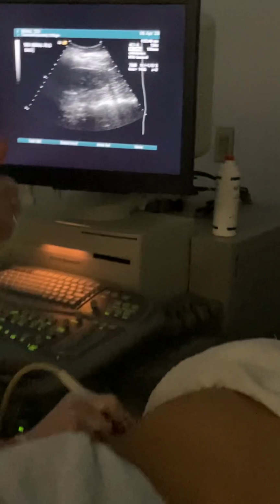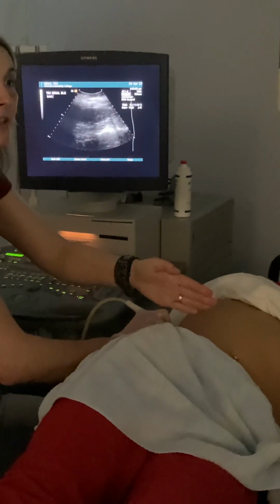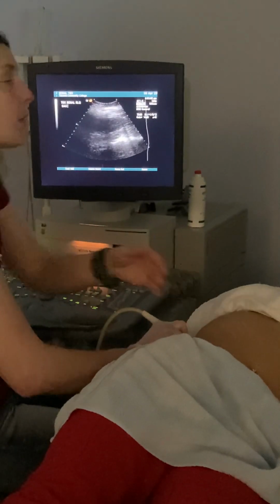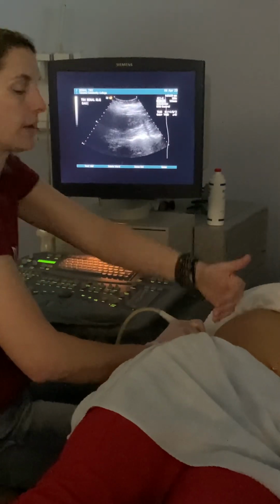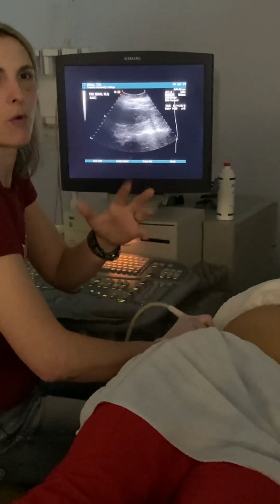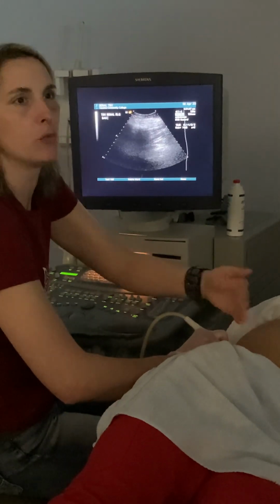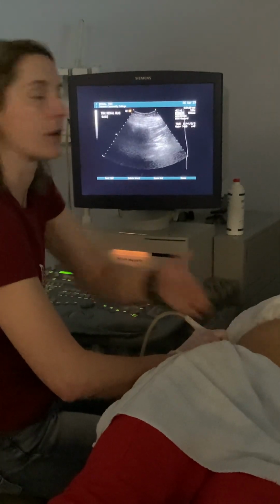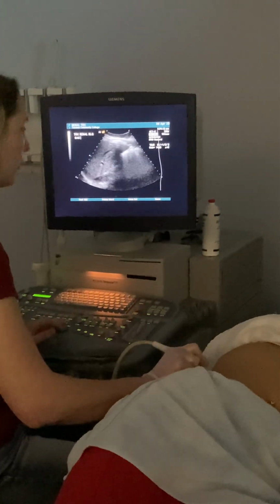So those ones are the easy ones. And like Masha brought up, if we have one that's totally horizontal in here, we just have to pick a side. So I might say superior / lateral right. So like, hey, I called the superior the lateral right aspect. So we might have to kind of make up our own superior and inferior. But for the most part, they're going to be in there slightly angled, so you will have more of a true superior and inferior. Okay, so we'll do our SAG image.